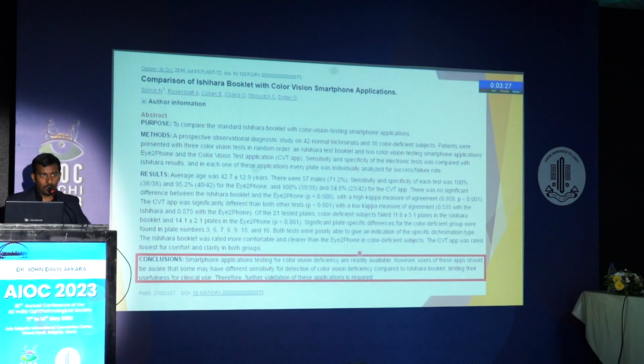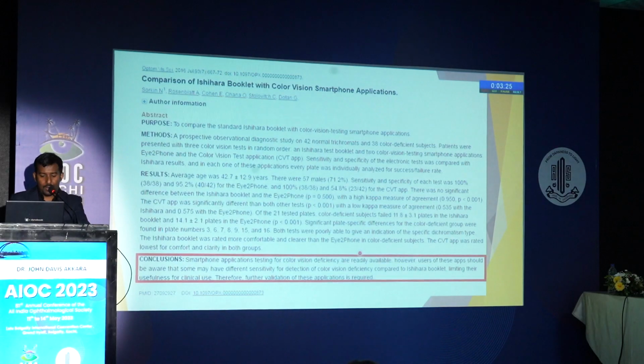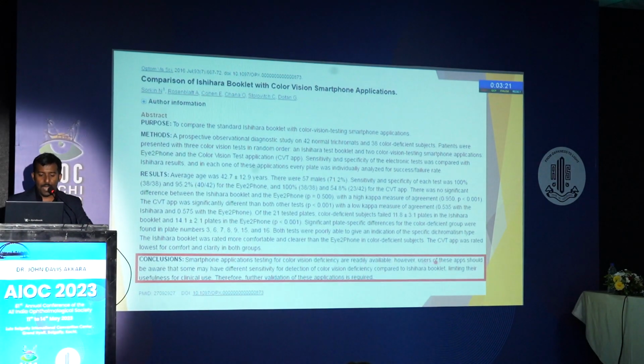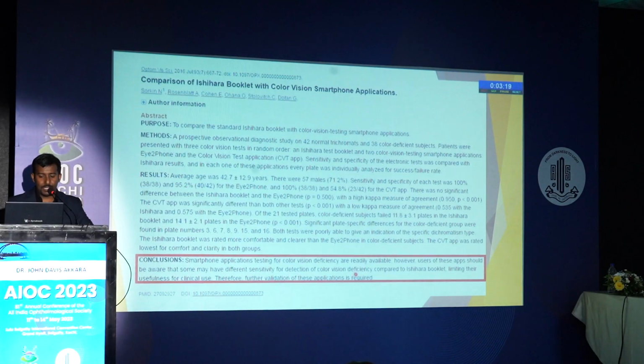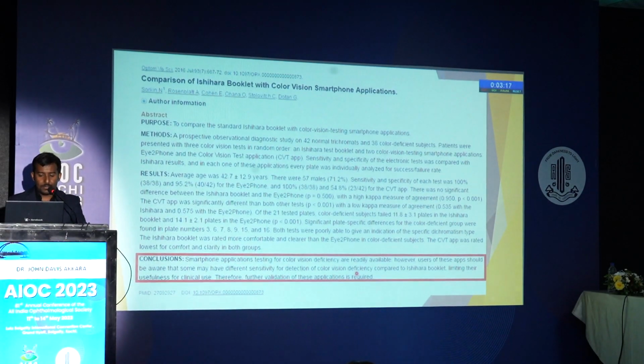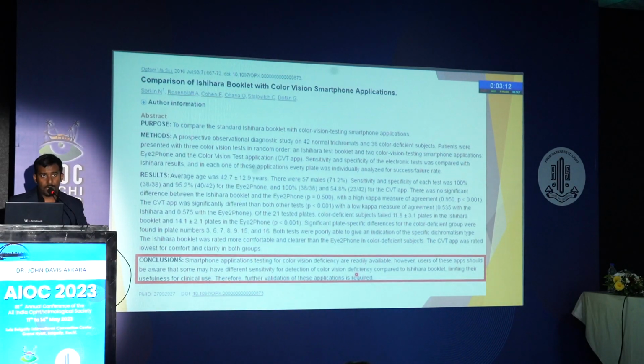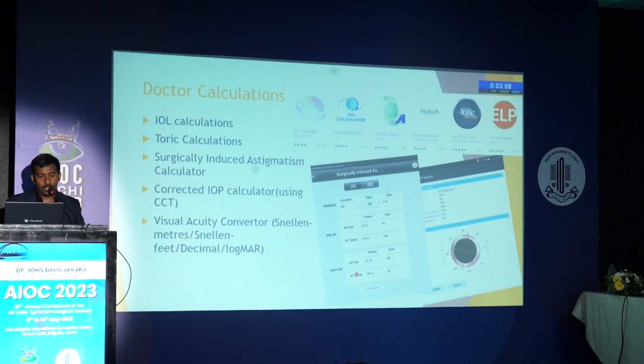Then I had to just mention that there have been studies which show that these apps may have different sensitivity for detection of color vision deficiency. But let me assure you that I have been using it regularly, and the color vision testing is working well.